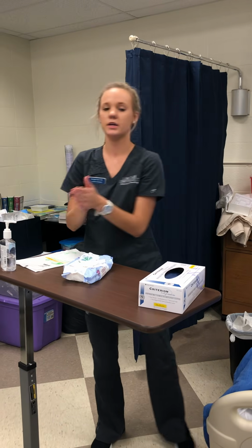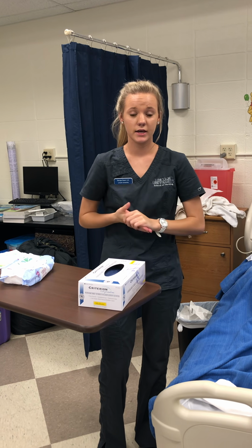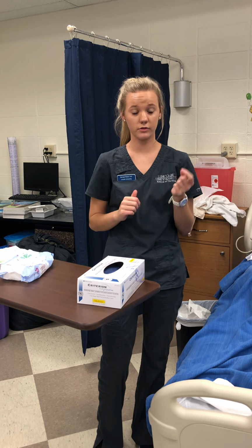I would do hand hygiene, and then I would exit the room and go document the time and date of the removal, how my patient tolerated it, the amount and color and characteristics of the urine that was in the bag, as well as if the balloon was intact, which it was. So I would document all of those things.